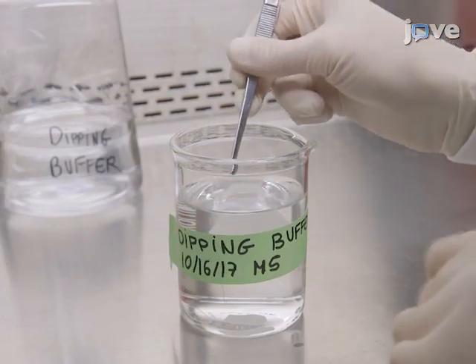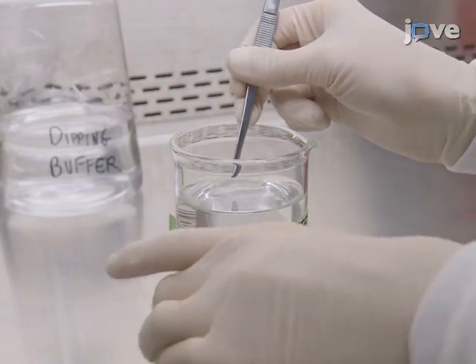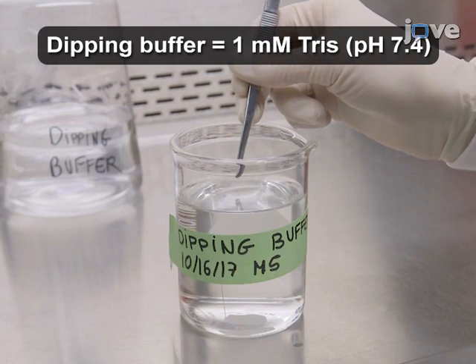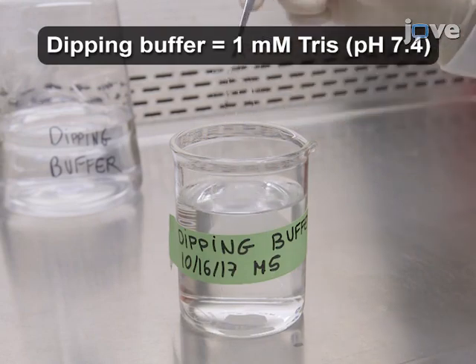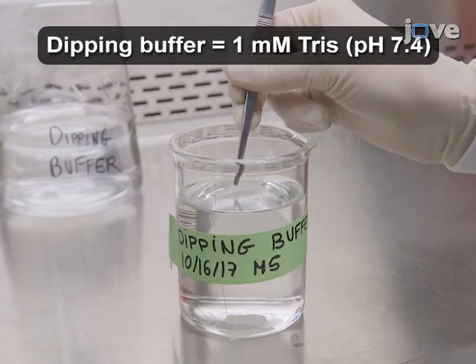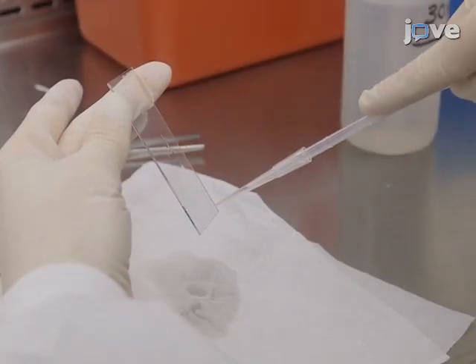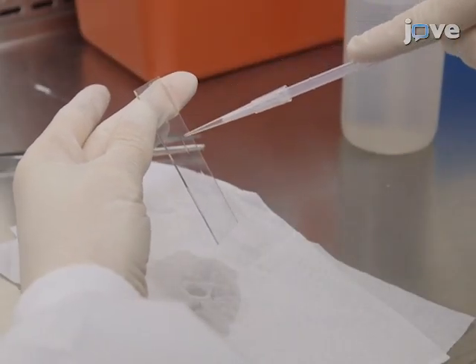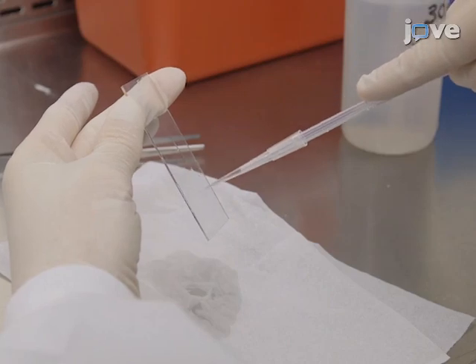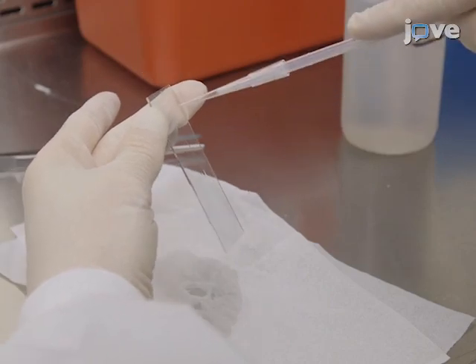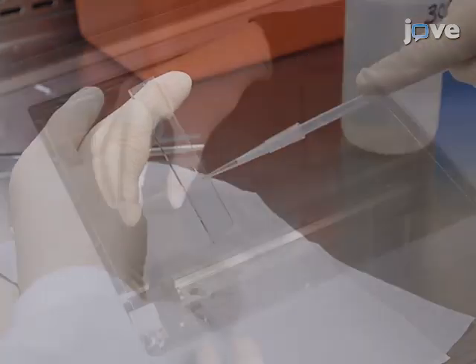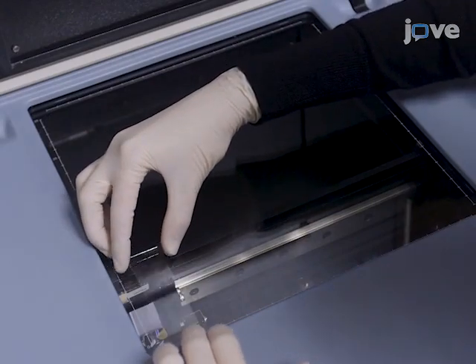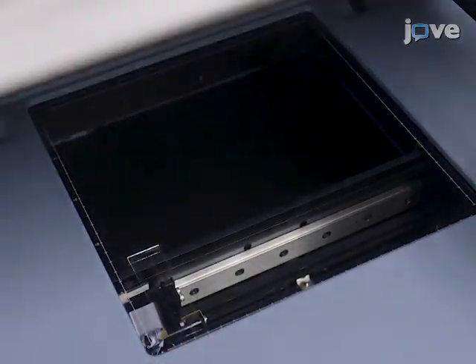Next, immerse the slide twice into 200 milliliters of a freshly prepared dipping buffer. Dry the microarray carefully for approximately one minute by aspirating excess fluid very carefully from the top to the bottom of the slide without touching the slide surface. Analyze the slide in a microarray scanner reader as demonstrated later in this video.